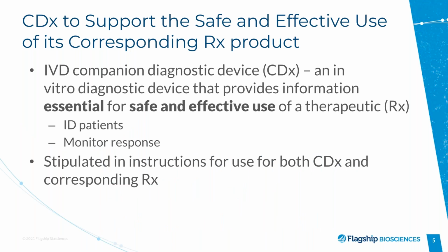So companion diagnostics are used to support the safe and effective use of its corresponding pharmaceutical product. Susanna, did you want to jump in and talk a little bit about what this looks like? Of course, thank you, Meredith, and hello, everyone. It's a great pleasure to be with you today.